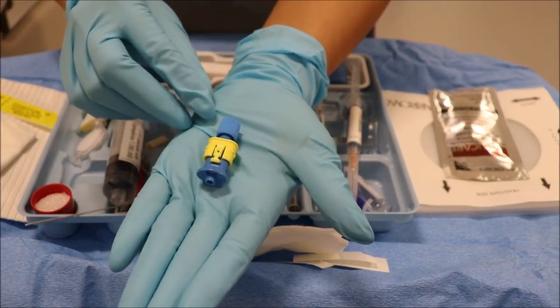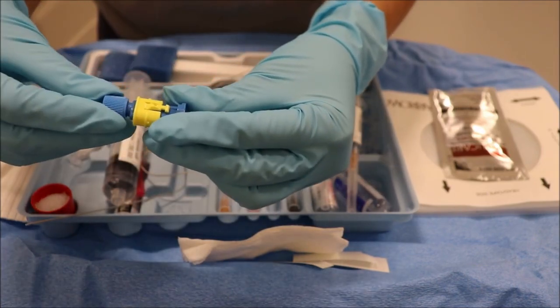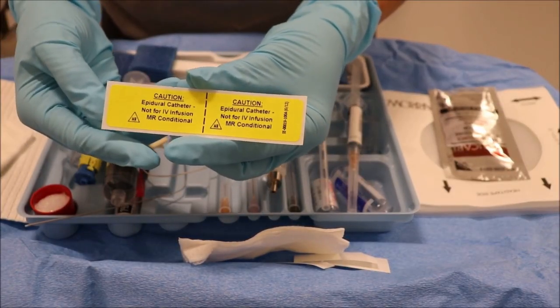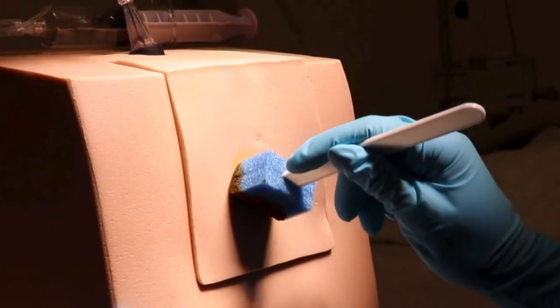The securement device must be inserted to the catheter through this end, then push and snap the yellow tab to lock it in place. The epidural catheter label should be applied to the catheter once secured. Let the patient know you're cleaning their back.